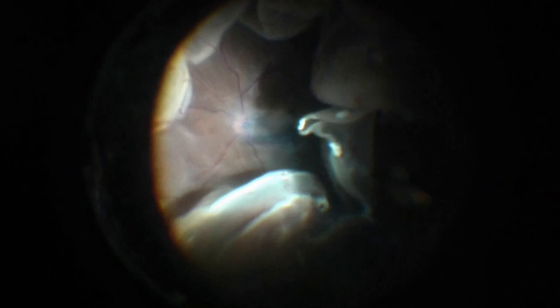Brilliant blue dye was used to stain the internal limiting membrane and to ensure that there weren't areas of remnant posterior hyaloid still attached.